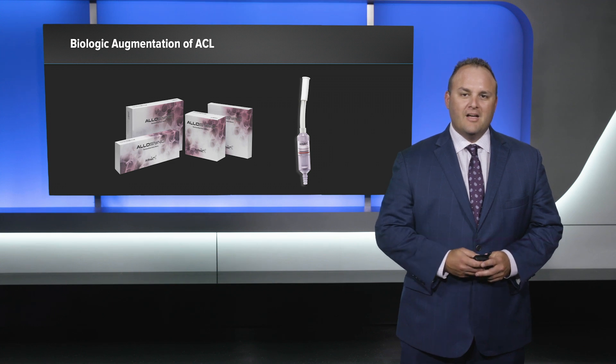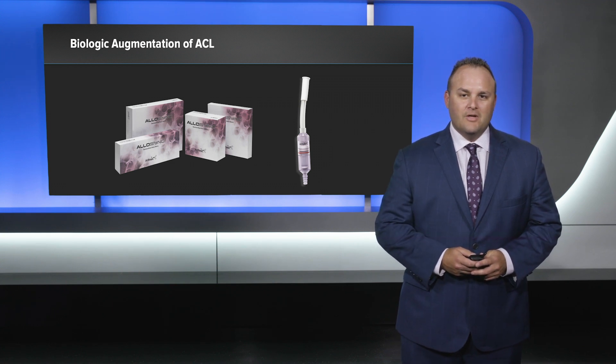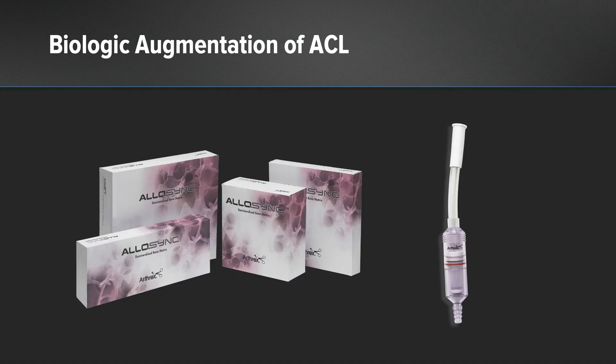We present the biologic augmentation of the ACL. We use AlloSync Pure and combine that with bone marrow concentrate, and now we add in autograft bone to our mixture, harvested using the Arthrex GraftNet.